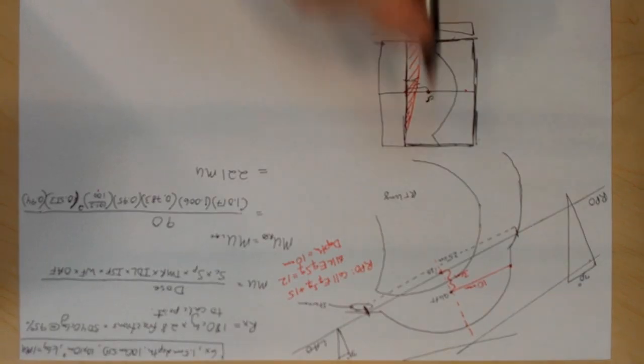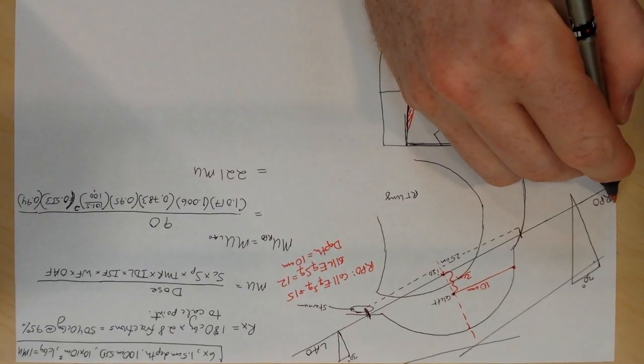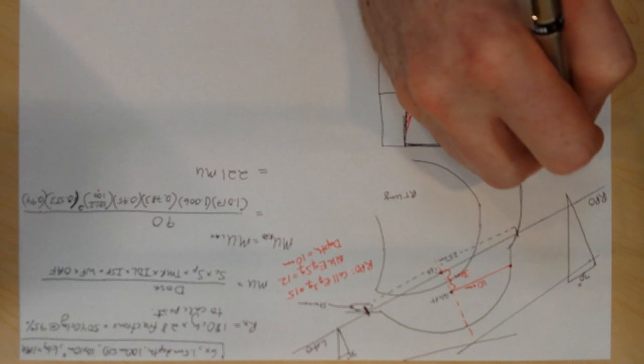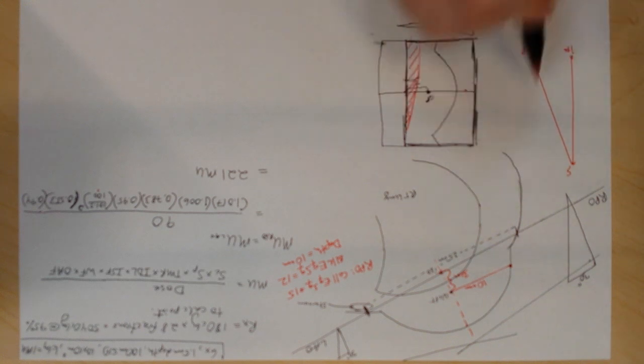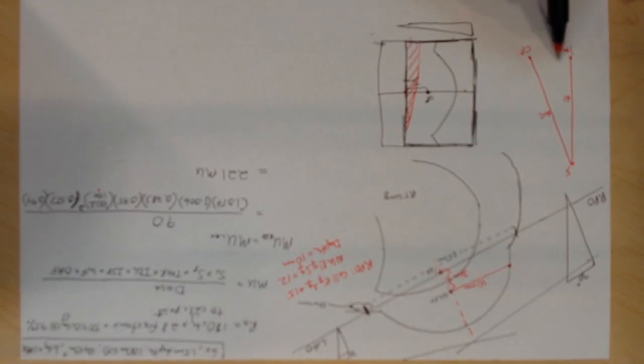Okay. Now some might argue, well, technically you're off axis, and if we draw a triangle from the source to that calc point, let me illustrate it here. This is source, ISO, and this is calc point. This distance is going to be larger than this distance, so that's going to affect this. Well, I'm assuming that because I'm only 3 centimeters off, that this is negligible.